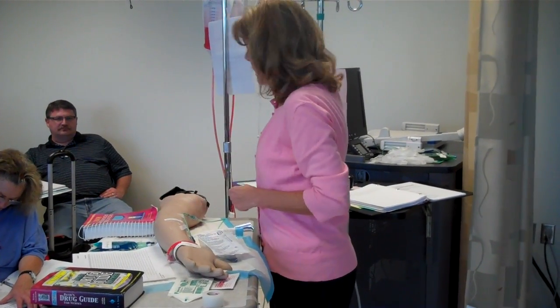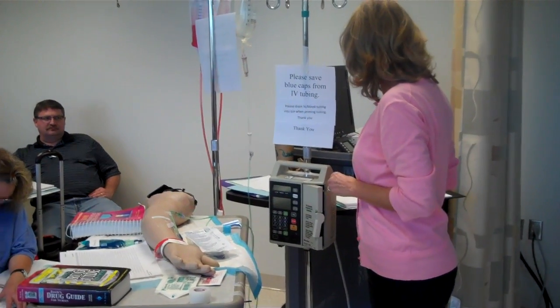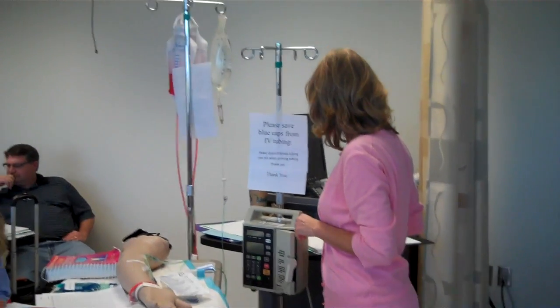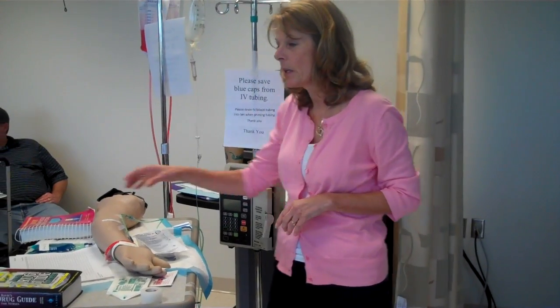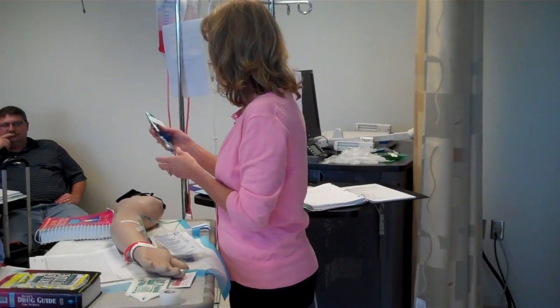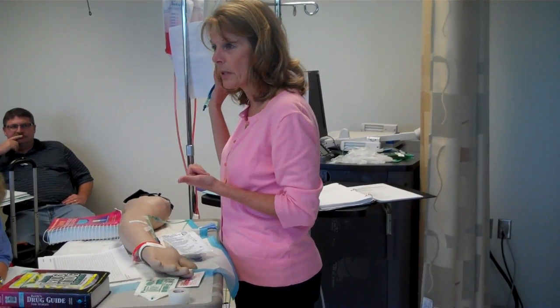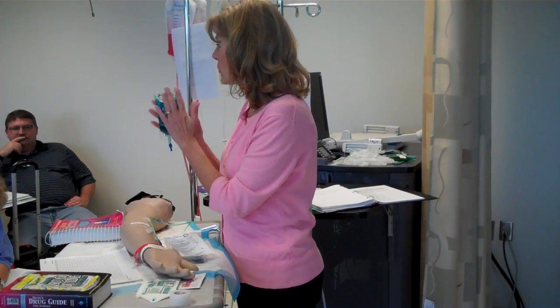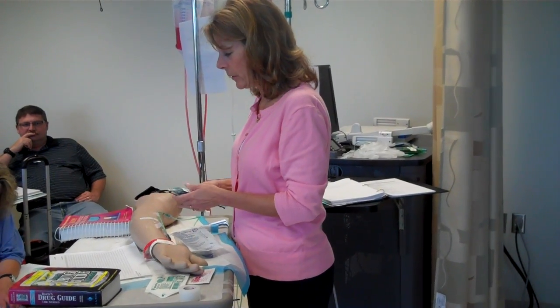Alright? So what I want to do is, I checked my meds, I checked compatibility, I figured out my drip factor. The only other thing I didn't do was step 6, and you want to do this, and I'm sure you did it with your primary, is just CEL. So I make sure it's clear, and I check the expiration date, and I make sure there's no leaks. So just remember CEL anytime you're hanging a new antibiotic, and so that looks great.